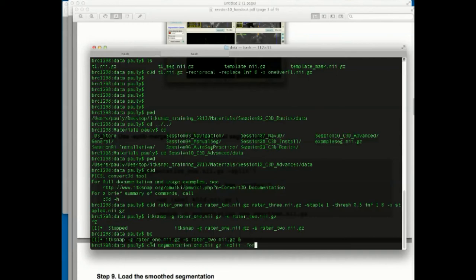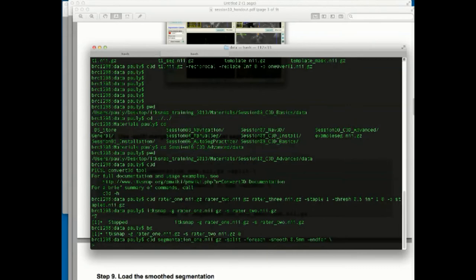So we're going to say for each, which means do something for each of the images on the stack. We're going to smooth each of them by this amount, and that's the only thing I'm going to do. I'm going to end the for loop, and then you have the backslashes here to, okay, let me also use the backslashes just to show how that works. See, the command didn't actually run. It gave me back what is called a secondary prompt, which is the arrow sign.